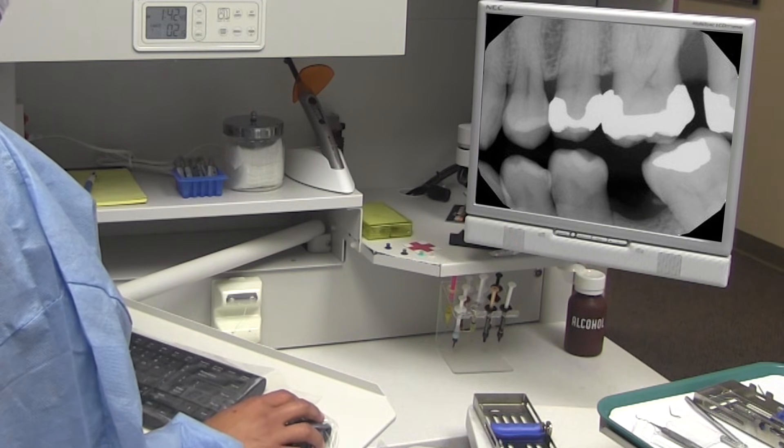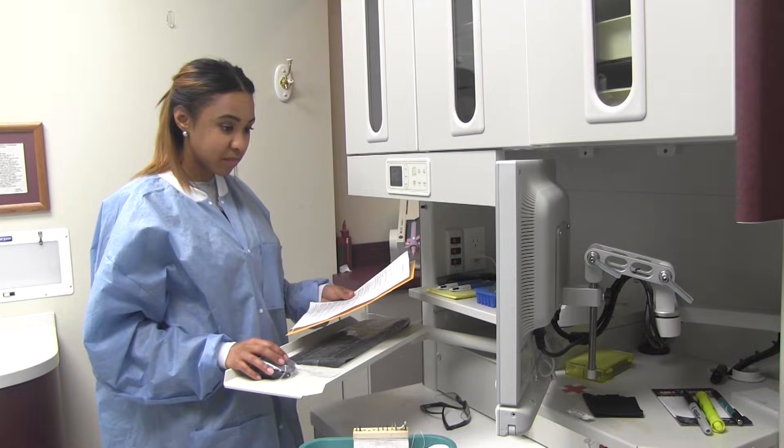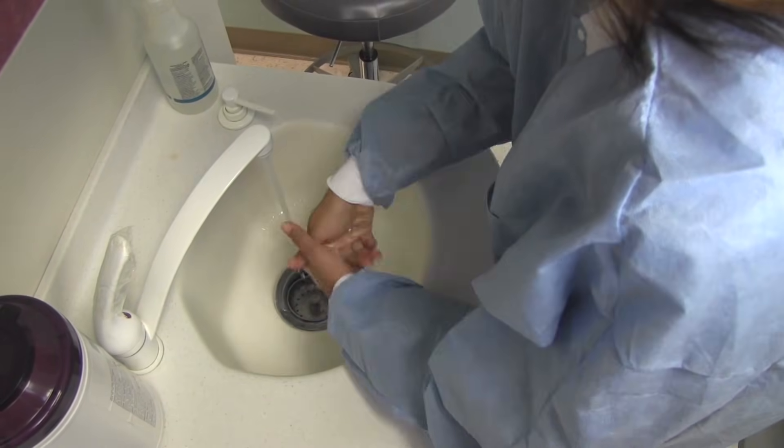Have the patient's medical chart and radiographs ready. Review the patient's medical and dental history. Before you meet the patient, wash your hands.